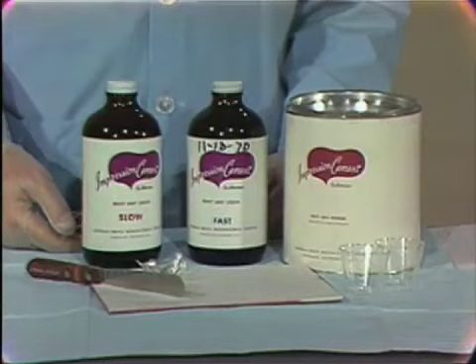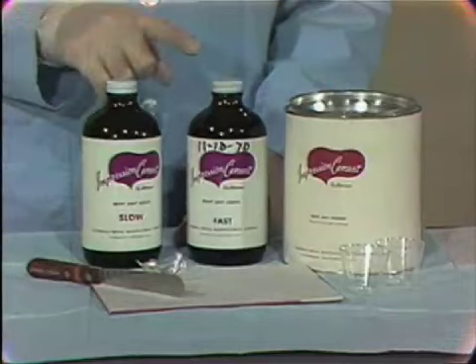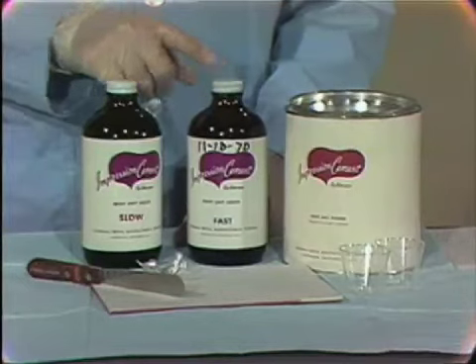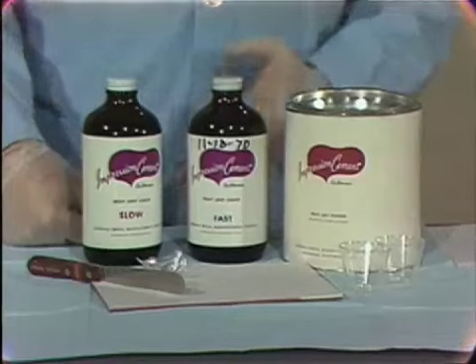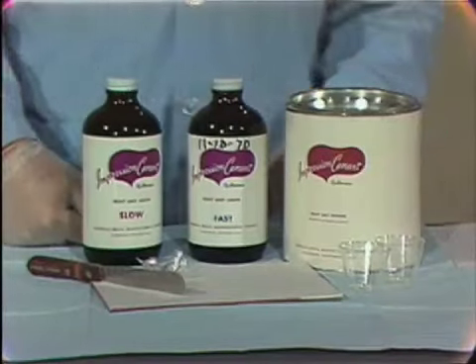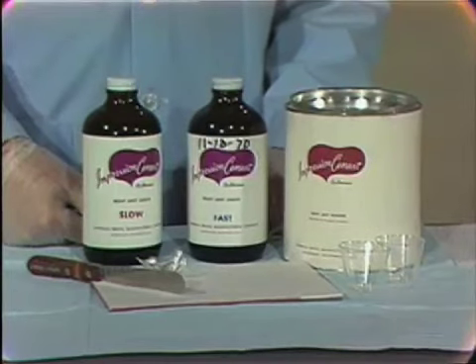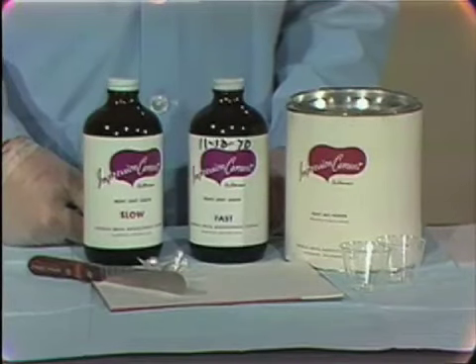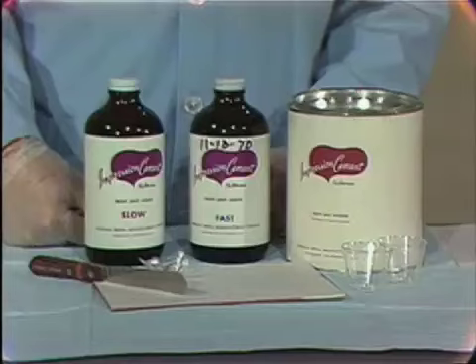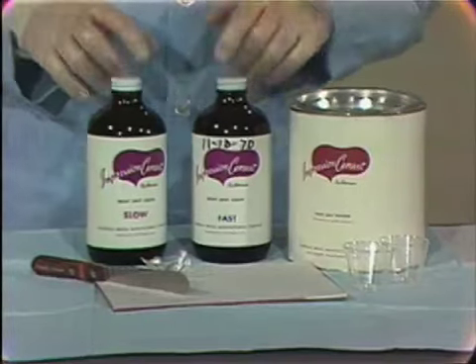It should have a controlled setting time. This material has a fast and a slow liquid that can be used to modify the set of the material according to the temperature, humidity, and the time that you would like. The ideal impression material would be one that you could mix properly, load the tray, place the tray in the mouth. As soon as it's in the mouth, if it would set immediately, this would be the ideal situation. So through the control of a fast and a slow liquid, we can vary the setting time.